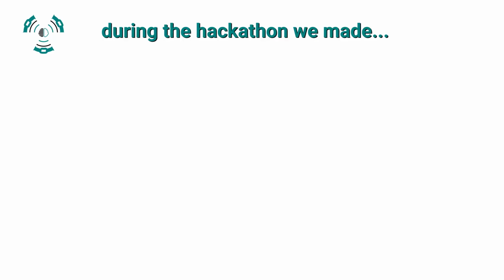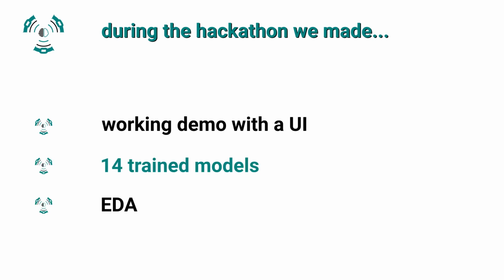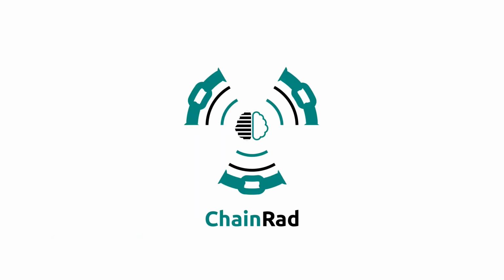We are really proud of our submission, since during the hackathon we made the following things: working demo with the UI, 14 trained models, EDA, and the validation plan. Please support us to have the chance to build better models and software. For this we need to have more data and more computational capacity.